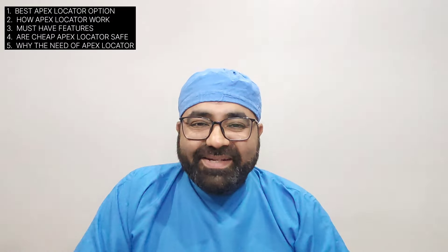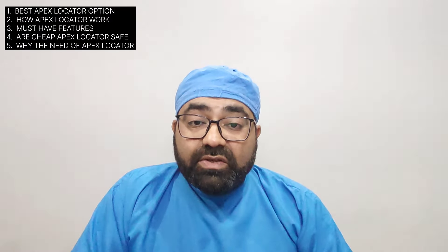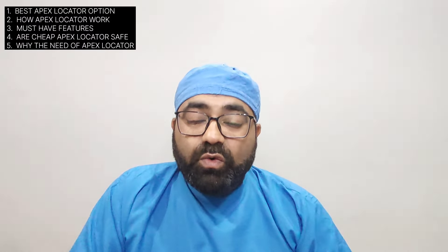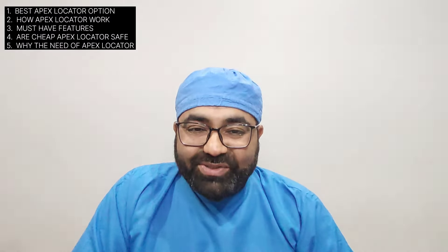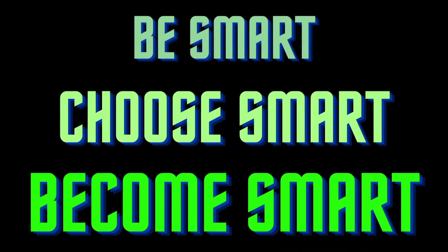Apex locator is one of the most important equipment required for the bread-and-butter treatment of every dentist, and that is root canal treatment. A perfect and accurate RCT without an apex locator is not possible. So the question is: which apex locator should you buy? This is the main aim of this video. Welcome, I am Dr. Tarun Mawadiya from the Occidental Academy. Let's begin.